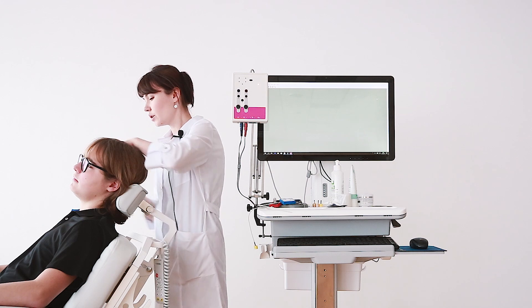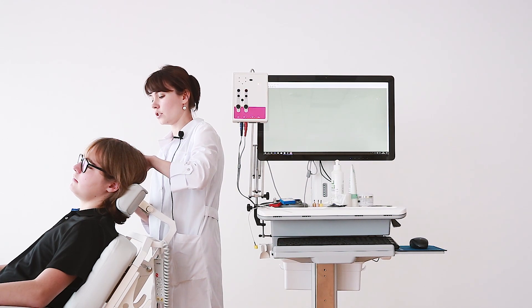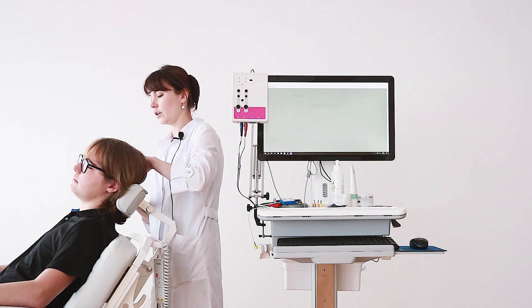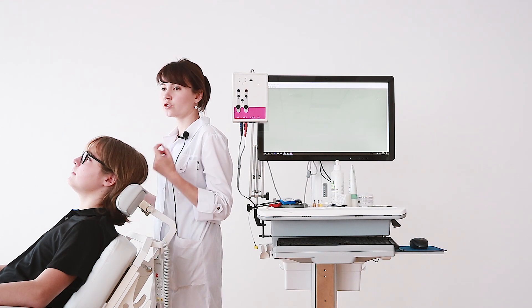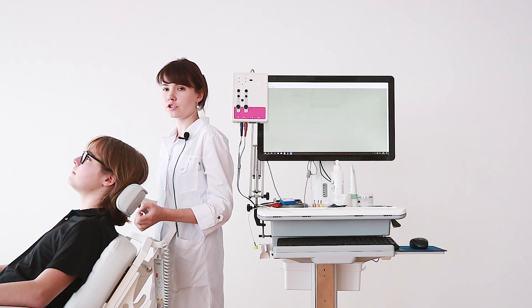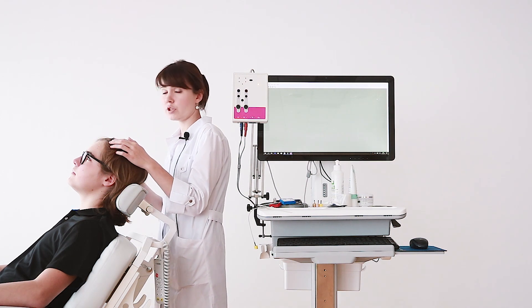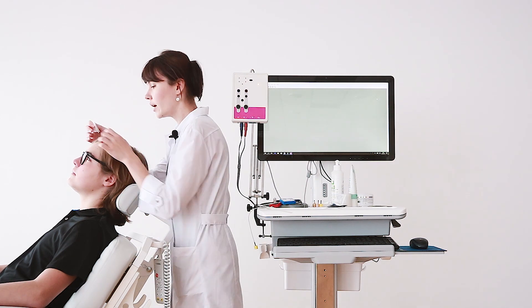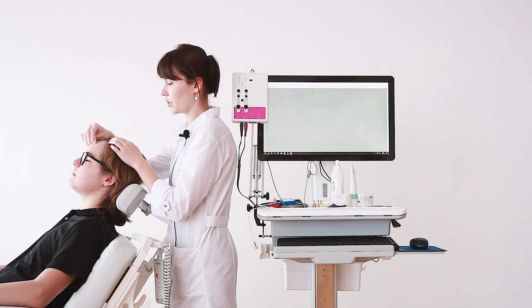The reference electrode we will put on the skin behind the contralateral mastoid. In our case, it is the right mastoid. We can choose another point to position the reference electrode, for example, on the forehead. But today we will use the contralateral mastoid. And the ground electrode we will put on the forehead of our patient.